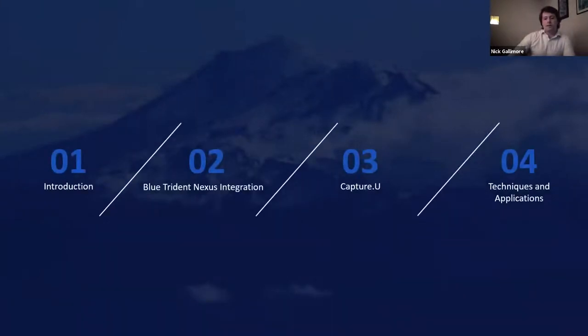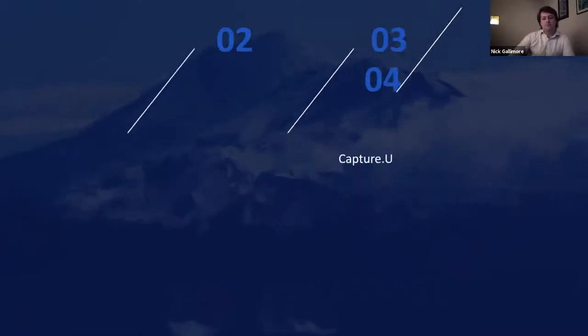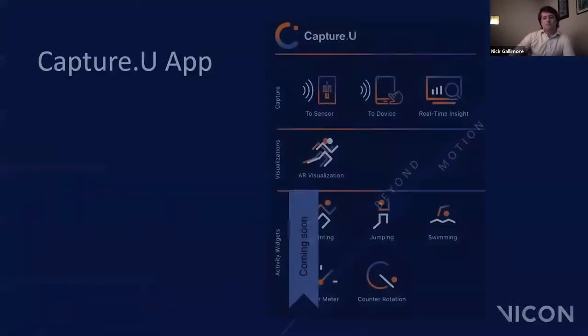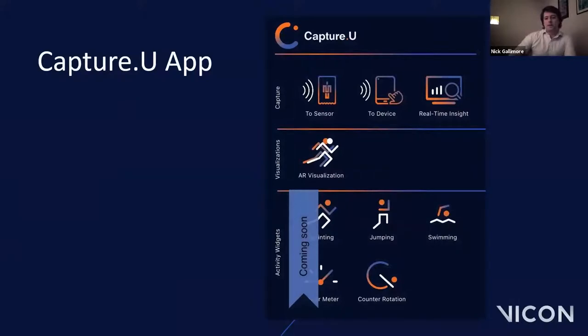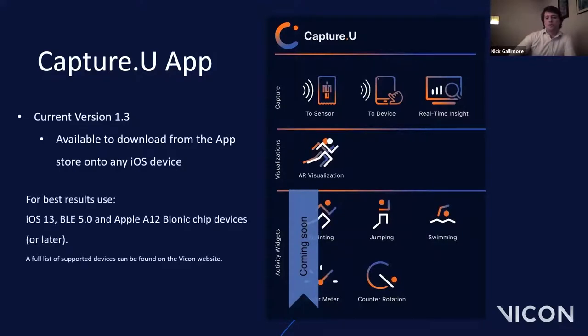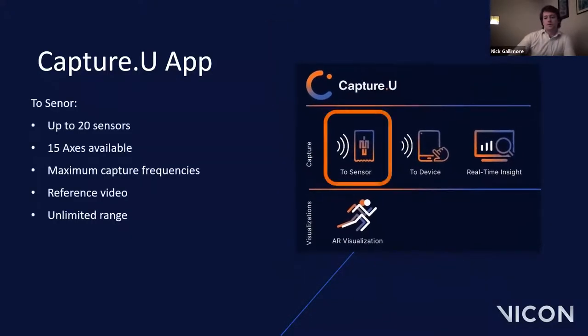Now that we have captured lab-based data, we can take the sensors out into the field. The CaptureU app can be downloaded onto any iOS device — we recommend iOS 13 or above with Bluetooth 5 for best results. There are four different capture methods. The first is 'Capture to Sensor,' which records data directly onto the individual sensors included in the trial. Using this mode, you can have up to 20 sensors with up to 15 axes of data, each component capturing at its maximum frame rate — for example, the high-G sensor captures at 1,600 Hz.